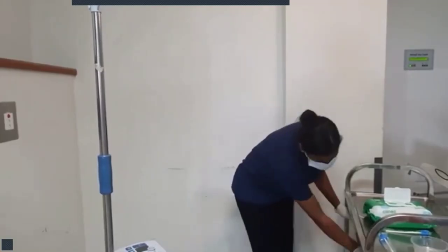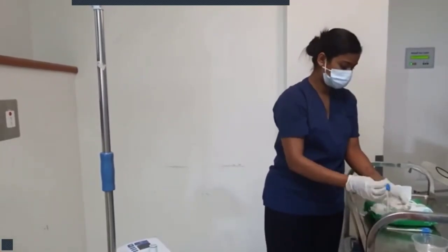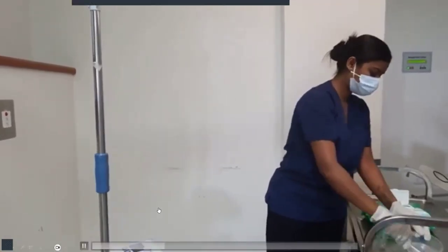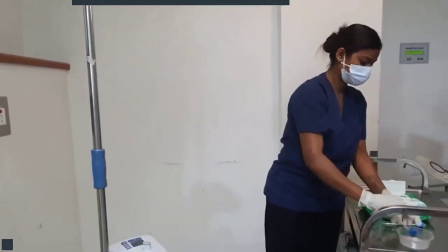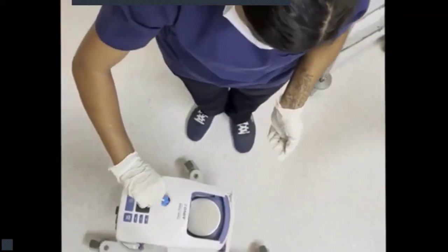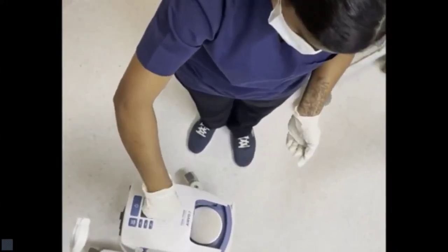Once you've removed all the circuits, clean outlet elbow on the right. Dip sponge stick onto the mixture of warm water with approved mild detergent solution. Thoroughly clean the outlet elbow from both ends using a sponge stick. Rotate sponge stick while cleaning.